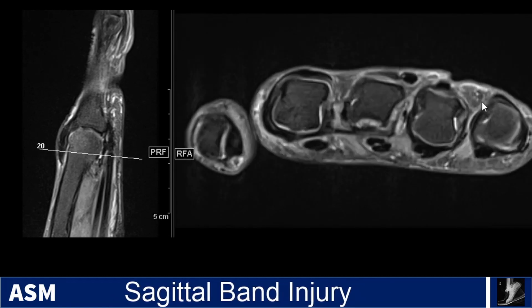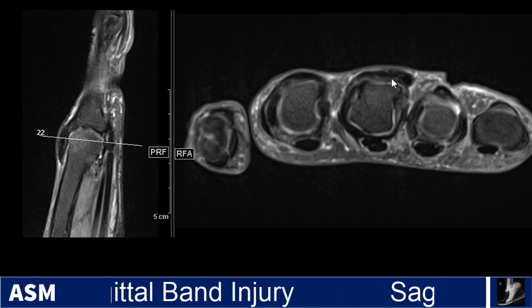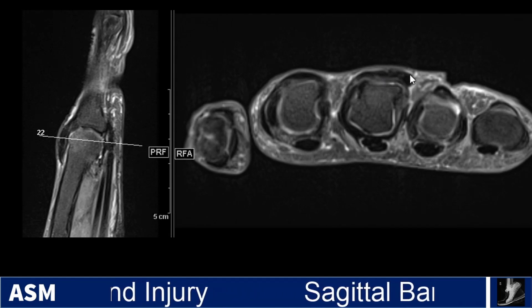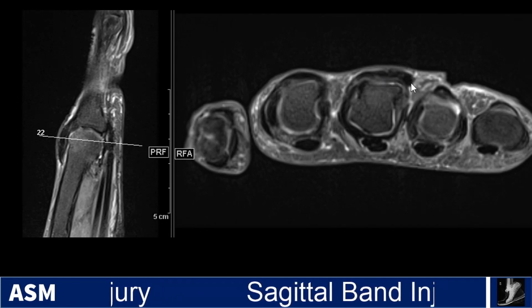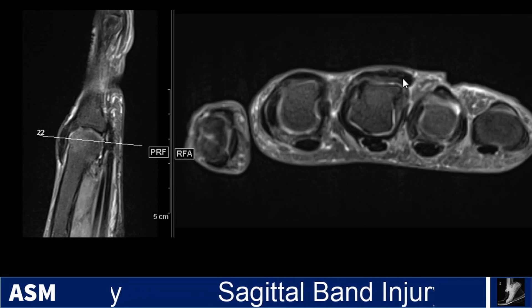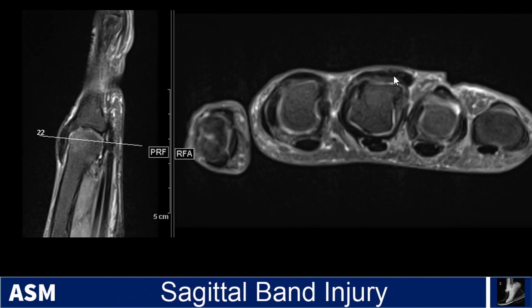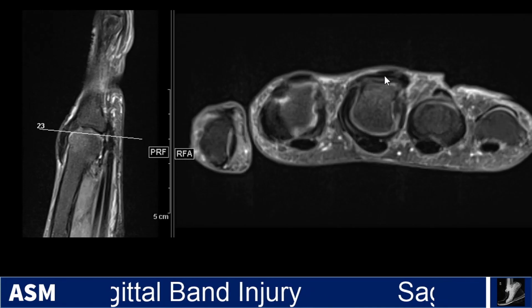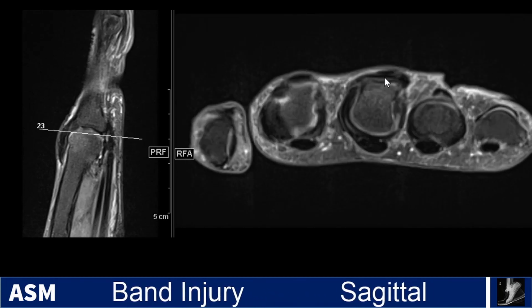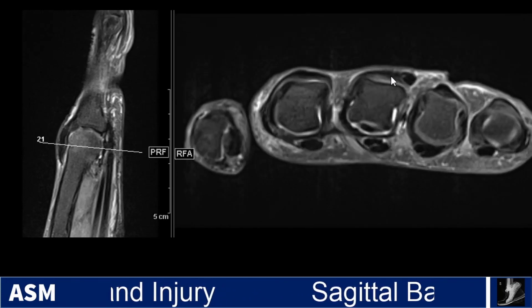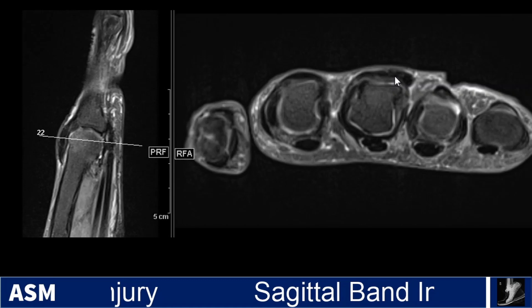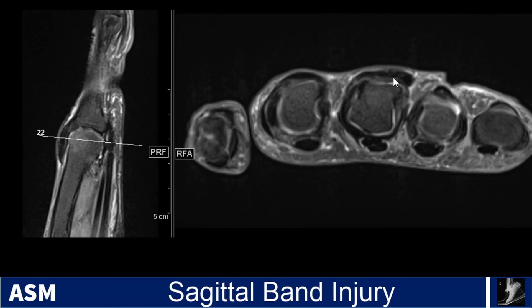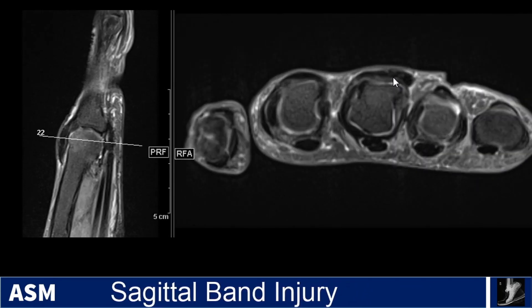Then you come over to the affected digit, the third digit. You can see that even in full extension, this extensor tendon is subluxed from its expected central position. There is marked thickening of the sagittal band, and it becomes considerably attenuated at certain parts as well. So this is already pretty suggestive of a sagittal band injury.